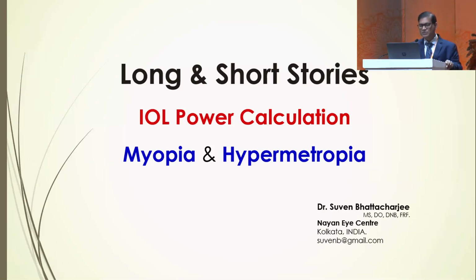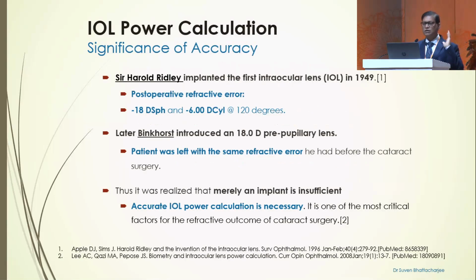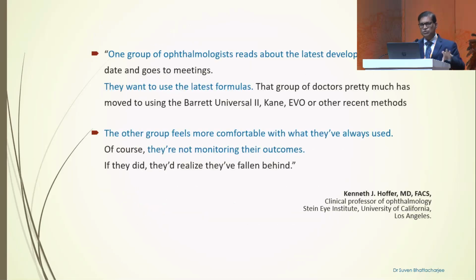So let's get on with our business. I'll try to stick to basics. I'm a little intimidated by these formulae. Like Doug Cox said, it is essential not only to implant an IOL, but to be accurate too. We have to give credit where it's due for the implantation of the IOL, but there were errors with Sir Harold Ridley and even Binkhorst. It is also true that we need to attend meetings like this and get updated so that we use the most current practices in our day-to-day work.